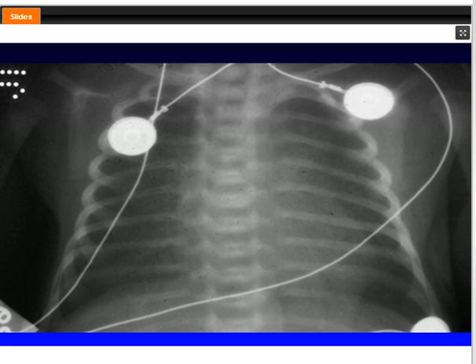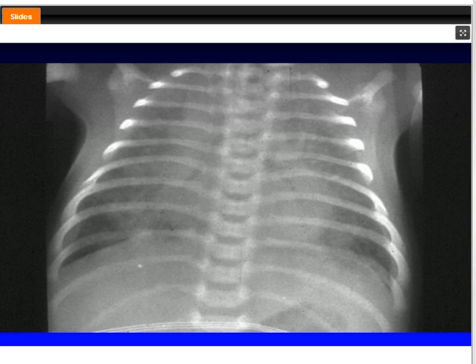And either of those become important, but in general, it's too little mean. This patient has a more than adequate mean airway pressure, as you can see by this baby being 9.5 ribs and very clear looking lung fields. This baby, on the other hand, has about the same volume, meaning rib counting, but look how much lung disease there is. And so someone says, well, I think I've inflated the baby. The baby's at 9.5 ribs, but the lungs aren't inflated. And again, you have to go by lung inflation. That becomes a critical part of what you're doing from that standpoint.